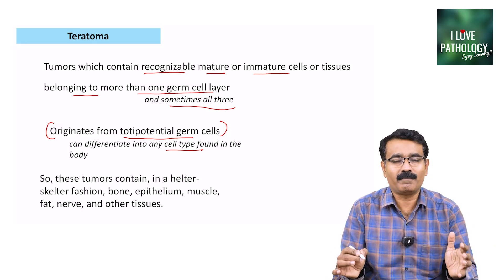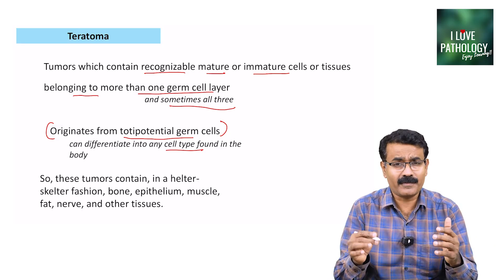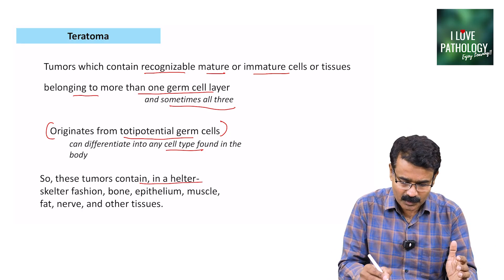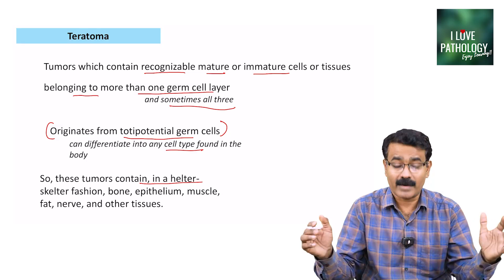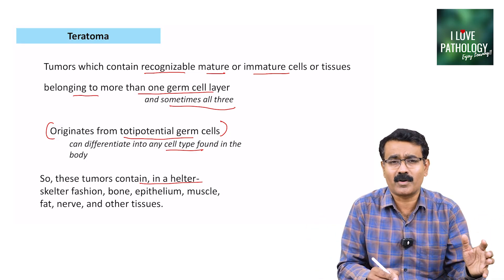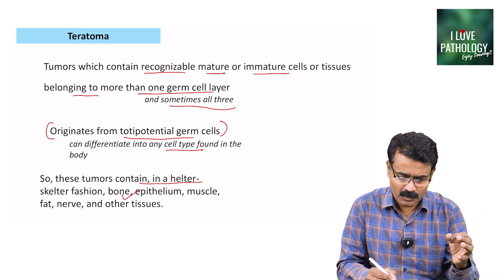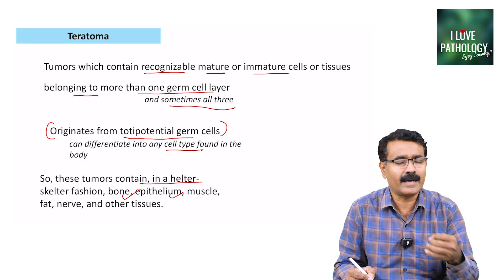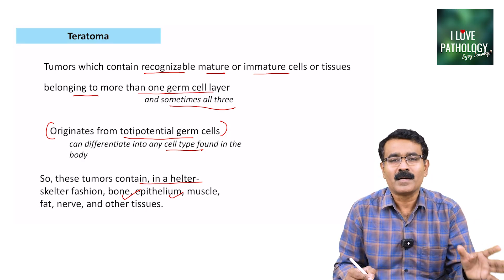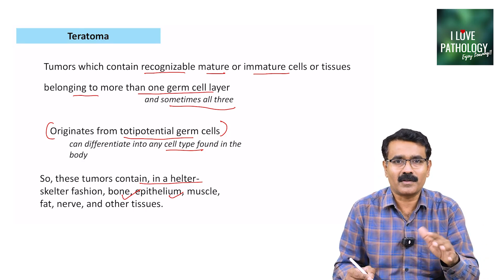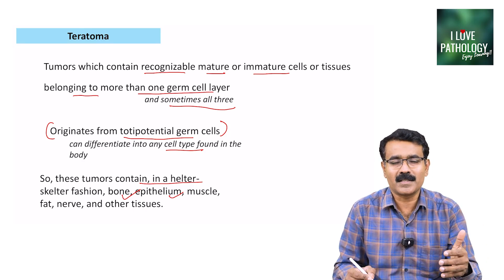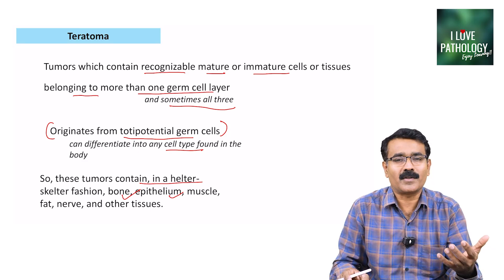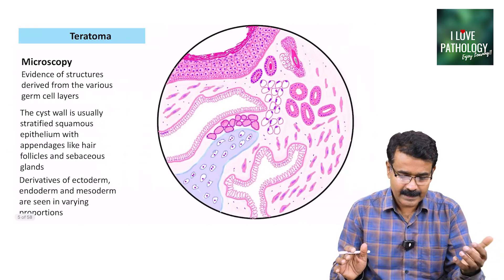By definition, in a teratoma you can see a helter-skelter fashion of all the tissues in the body — it could be bone, epithelium, muscle, fat, nerve, skin, and everything. Depending upon the derivatives of each germ cell layer, you can see components of all three germ cell layers.